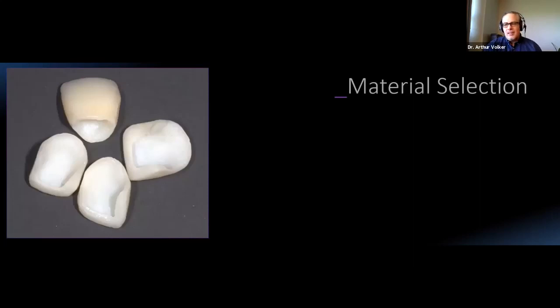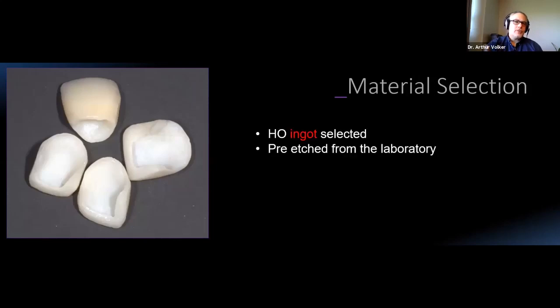The outcome is the follow-up, 6 years, even more. But here was my favorite picture of the whole case, because on the top, we knew we had to do a crown. So no surprise there, but look at the intaglio of the other teeth. You can see that we have a 3/4 crown and on tooth number 9, we have these smaller veneers, and it didn't matter of the prep design. All that mattered was preserving as much tooth structure as we can, preserving as much enamel as we can for bonding.